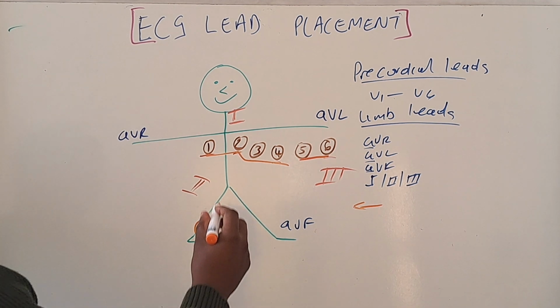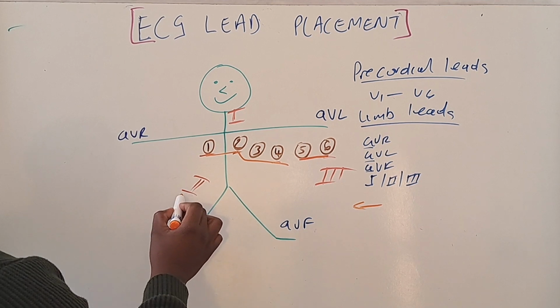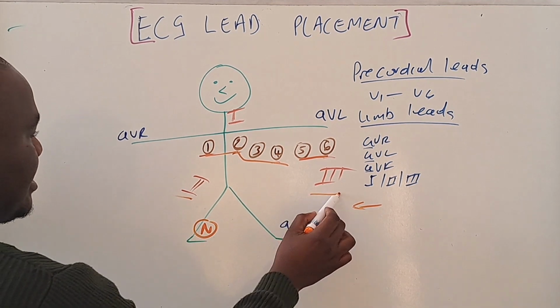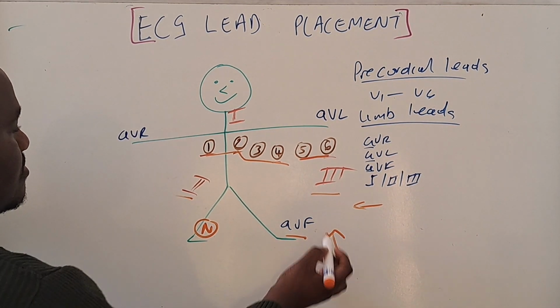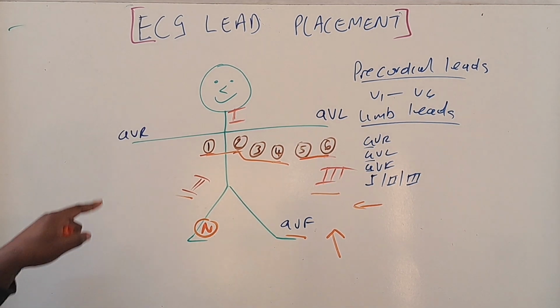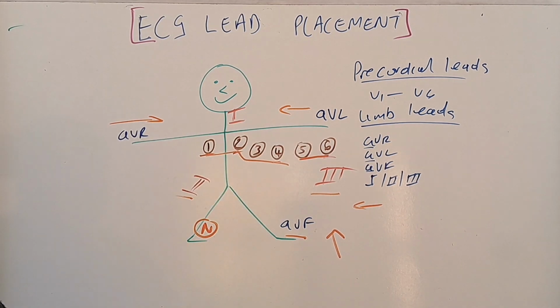And then lead 2, AVF, and lead 3, they look at the heart sort of from inferior up. And then this one, this direction, and this one, this direction.